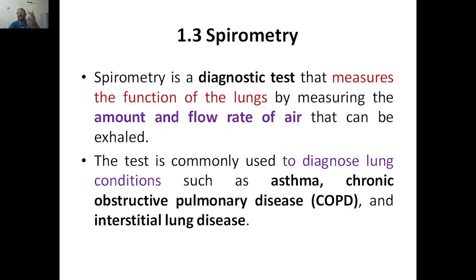So here, to detect the disease, we are using this test. That's why it is called a diagnostic test. Okay, so it can be used for asthma, COPD and interstitial lung disease.